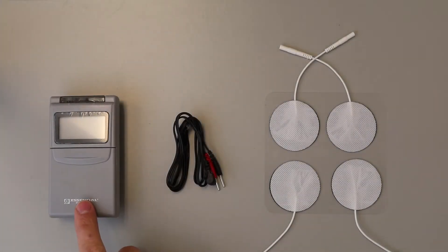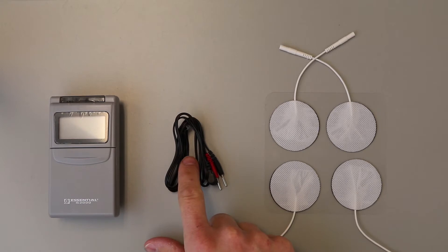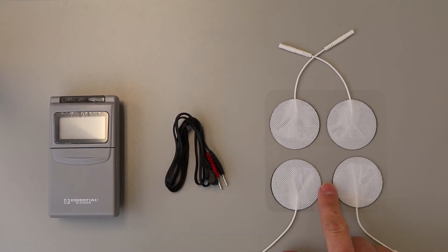Now there are a few parts of the TENS unit: the machine itself, the lead wires, and the electrodes.